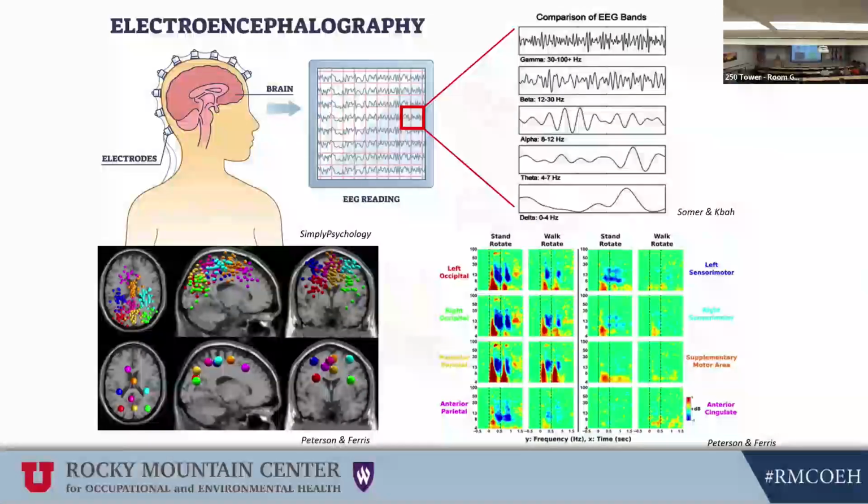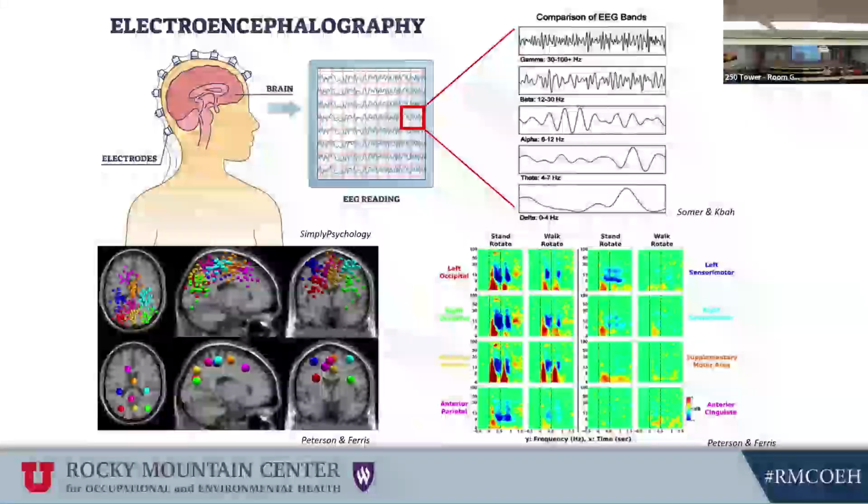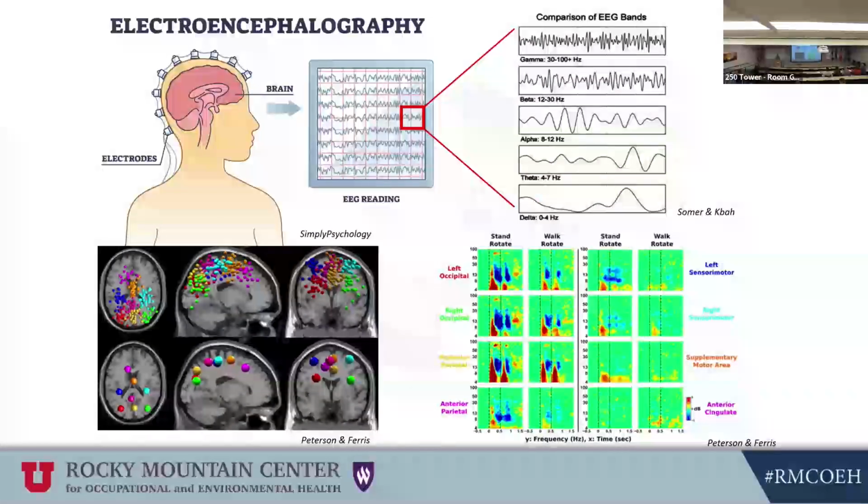the scalp. And then it records a mixed signal from multiple brain regions at the same time. And it also includes non-neural signals like eye blinks or muscle activity, making the raw signal very hard to interpret. But after lots of processing, we look at different frequency bands.